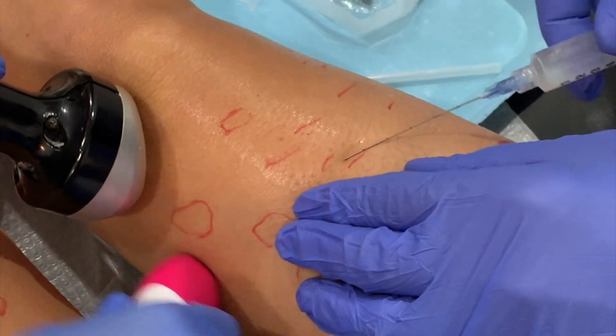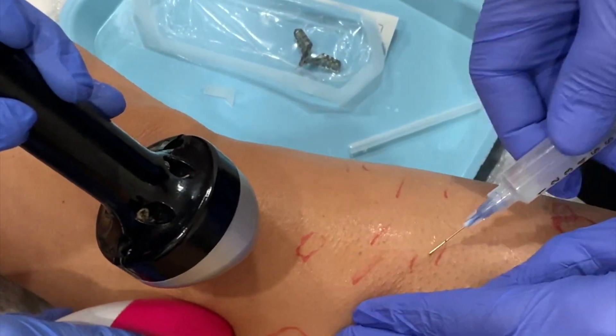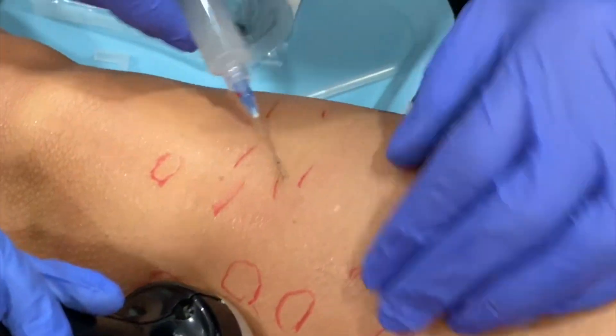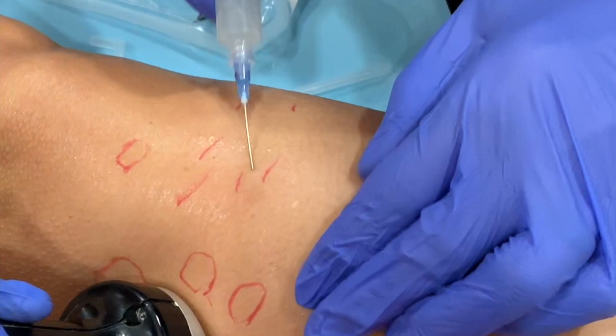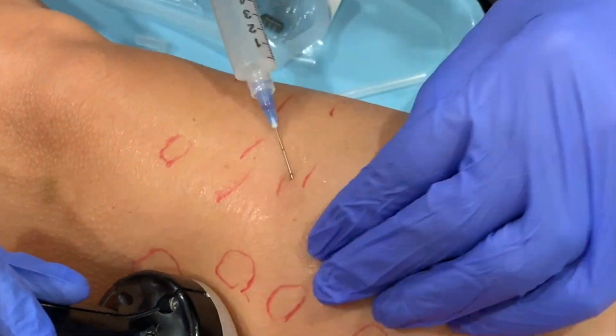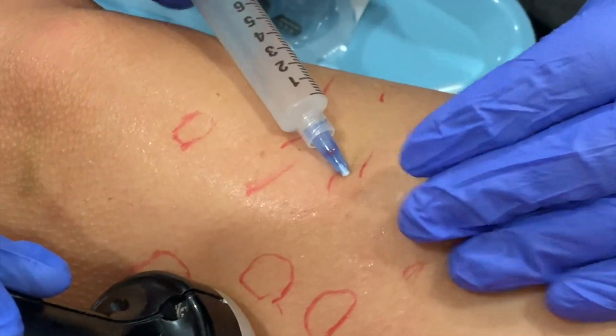You can see here that I am subsizing the fibrous bands of the cellulite. This is rather painless if done in the proper plane. I will then inject in the areas of the cellulite a little bit of Sculptra to fill in the small indentations of the cellulite.